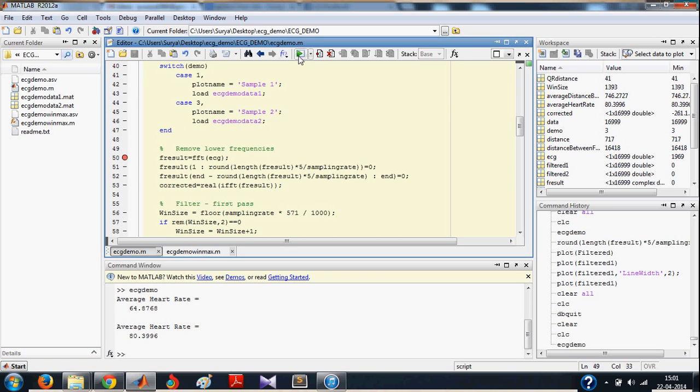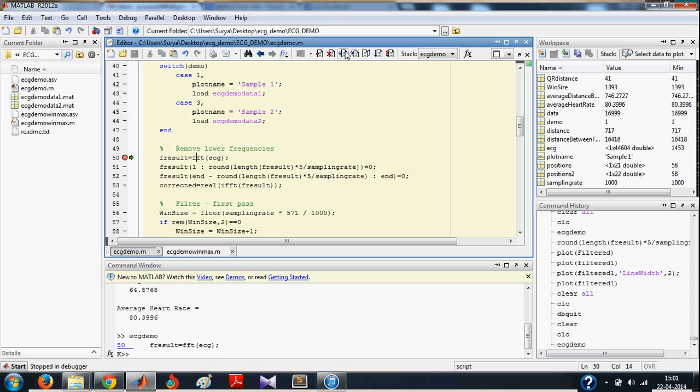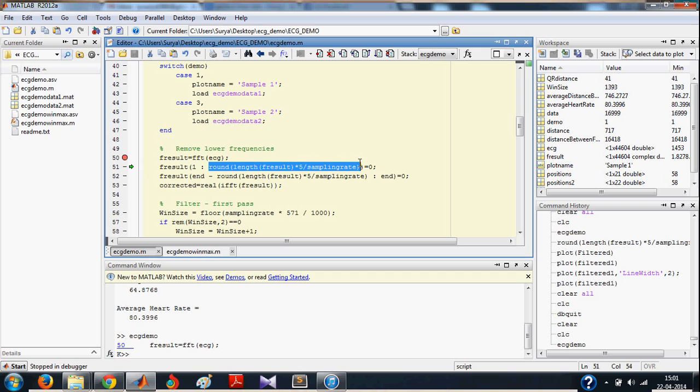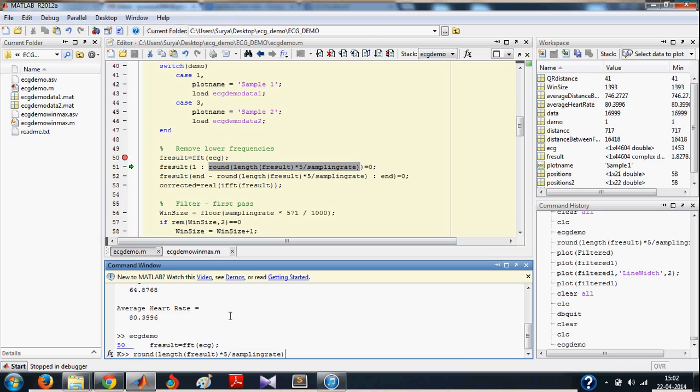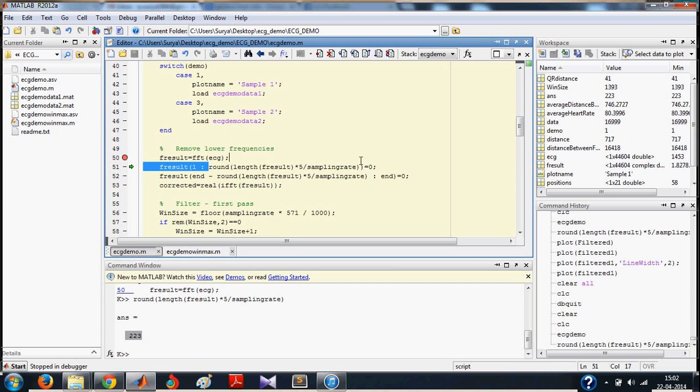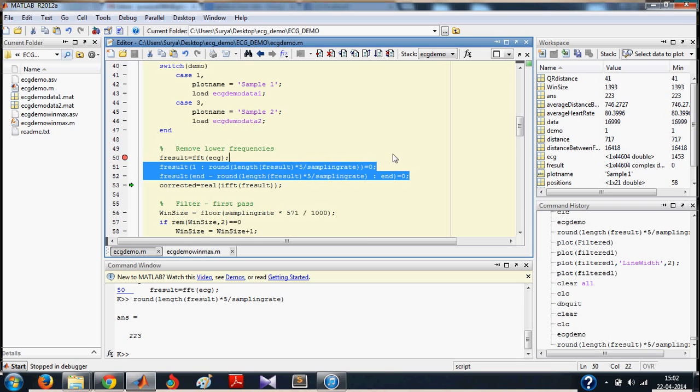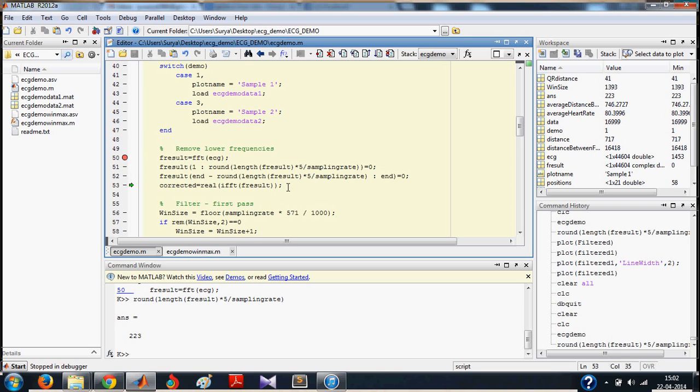First, as we have discussed before, we remove the lower frequency components. We do it by shifting into the Fourier domain first. And then, we make all the low frequency components 0. The value of this is 233 and the length of your sample is 44,604. So you are making the first 233 values in the frequency domain to 0. And in the next step, you are also making the last 233 values to 0. This means that you are removing the low frequency components. And then, you do an inverse Fourier transform to get the corrected ECG signal.